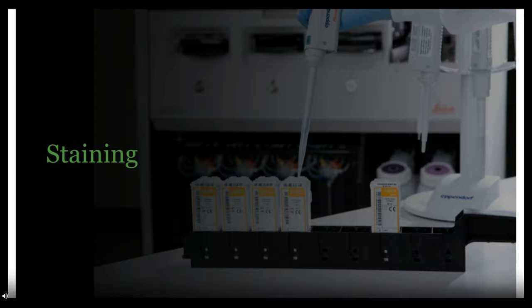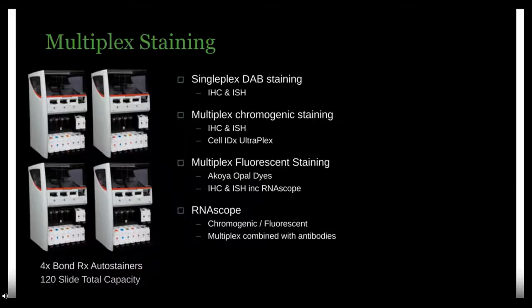So obviously our workflows will start with staining, and primarily our staining platforms comprise Leica Bond Rx autostainers. We started our Bond journey a number of years ago, and we have been collecting them ever since. We've got 4 now, and they are real workhorses.